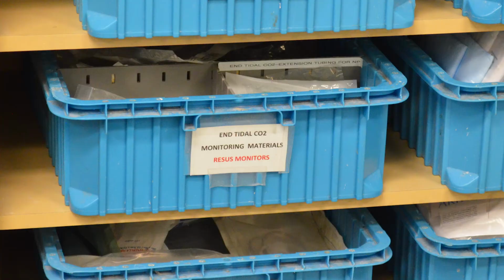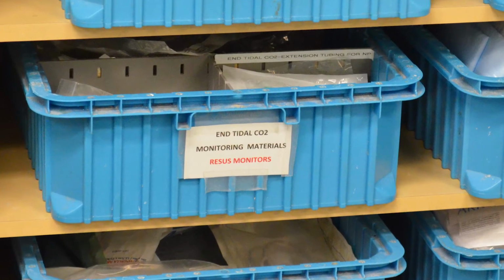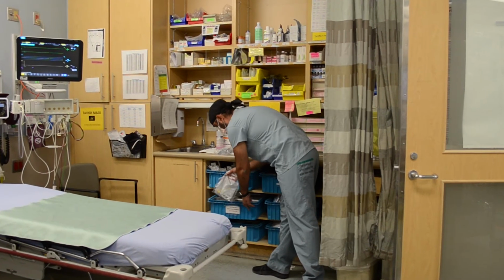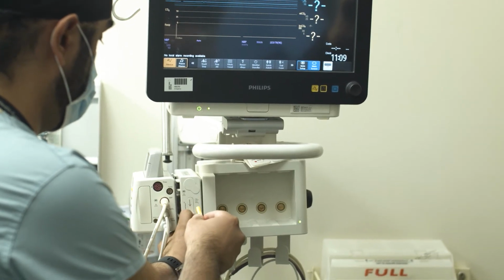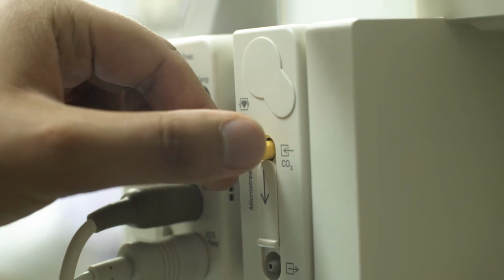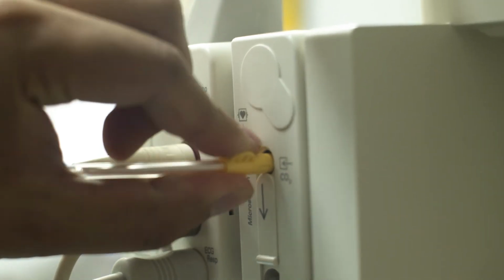The airway bags are stocked with colorimetric end-tidal CO2 detectors, but if you prefer a continuous detector instead, the attachment can be found in a bin under the sink in resus 1. The lead from the detector is simply inserted into this port on the monitor and twisted clockwise until it stops. A waveform will automatically display on the monitor when it detects CO2.